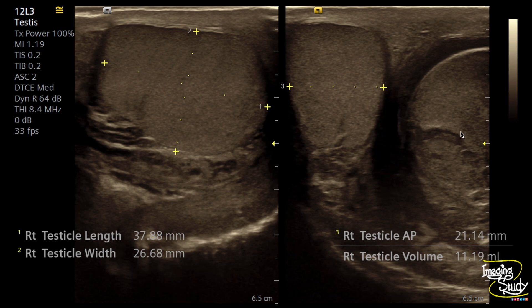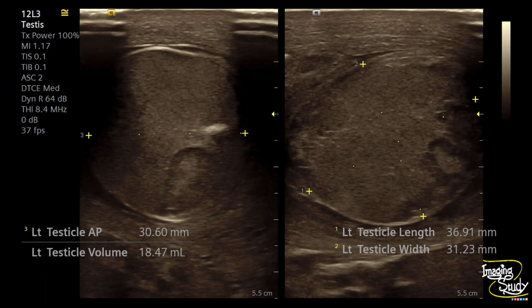The left hemiscrotal skin is quite thickened. There is mild collection here also. The glimpse of left testicular parenchyma shows an inhomogeneous pattern. Jumping into the left testis: it is swollen, hypoechoic, heterogeneous, and the shape is quite rounded or globular. The skin is thickened.